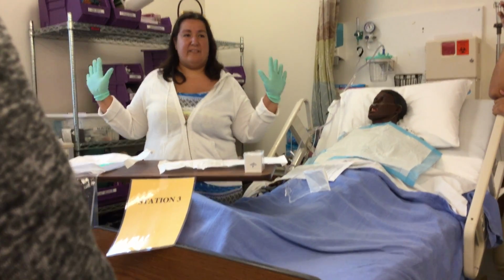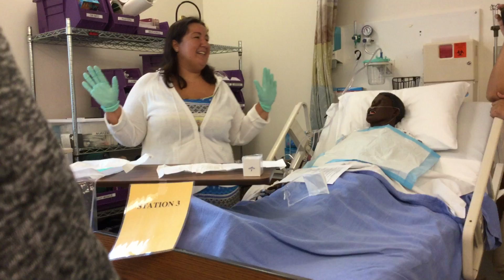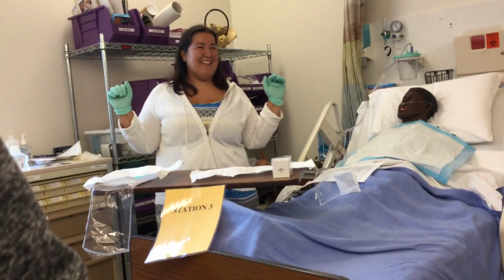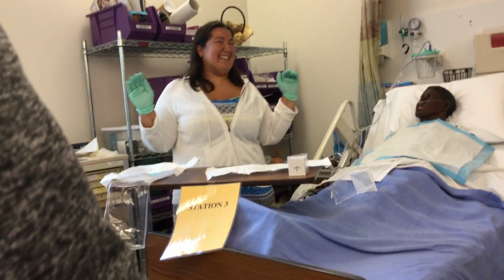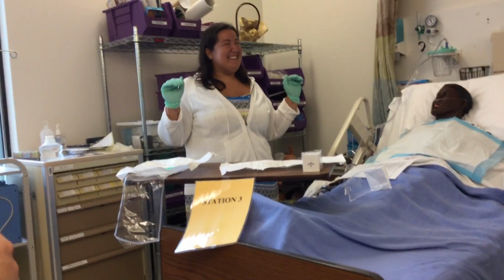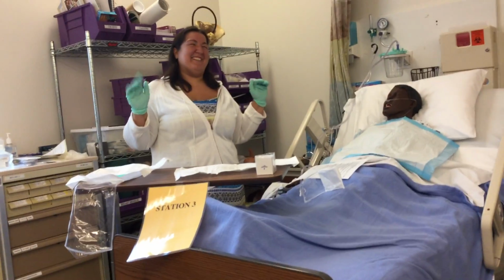It's covering your hands, it's protecting you enough. Just leave it alone. Because that's what I see, people trying to fix this up, and then all of a sudden they're touching their wrist, and now you've contaminated yourself. Is that what you did during your return? Yeah. You're looking at it. When I was practicing, I had a hard time. I got it for my catheter, but you couldn't let them go. Yeah, just let it go.